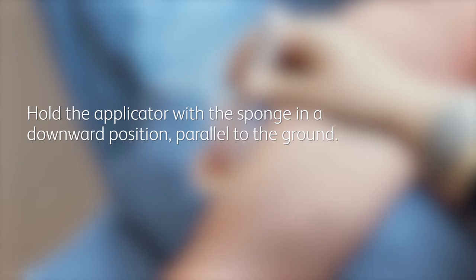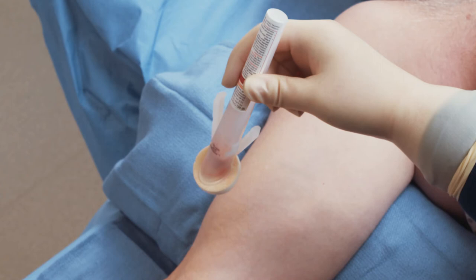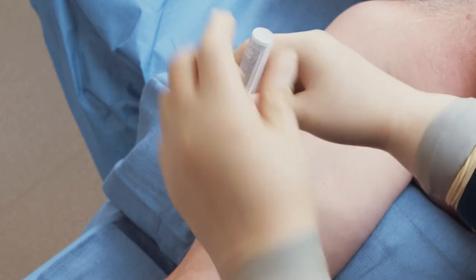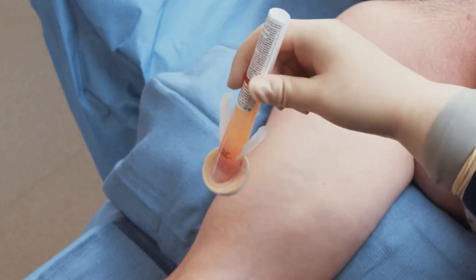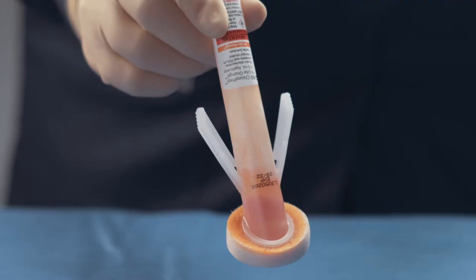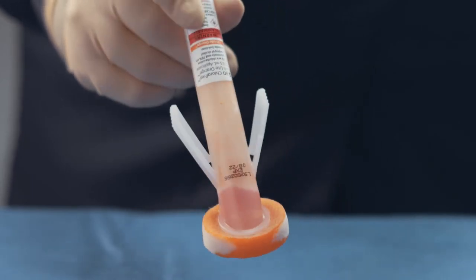Activate the applicator by holding it with the sponge in a downward position parallel to the ground. Place the wings between your thumb and forefinger. Pinch the wings only once to activate the applicator and release the antiseptic. It may be necessary to use two hands. This position allows the solution to properly load into the sponge upon activation.